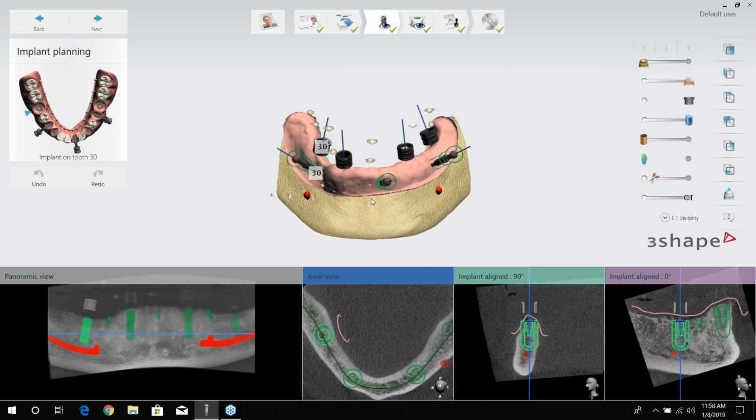Right now in the industry, I think it's a lot dependent on where you're located. I know there are some companies that increase the charge per sleeve, so you can get into several hundreds of dollars for a guide. Like what we print here, we charge $100 to print the guide, and then you buy your own sleeves, and then you would upcharge from there to cover that cost. So a couple hundred dollars, and some of them that charge per sleeve, you get into $1,000.